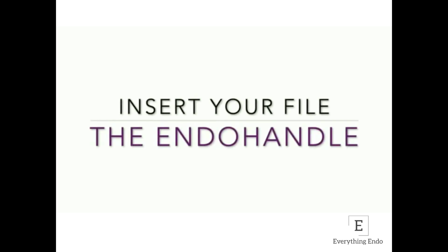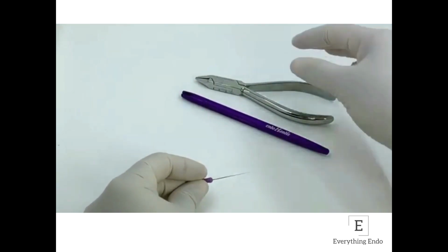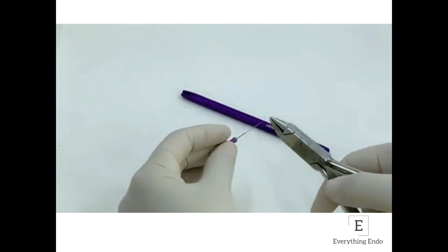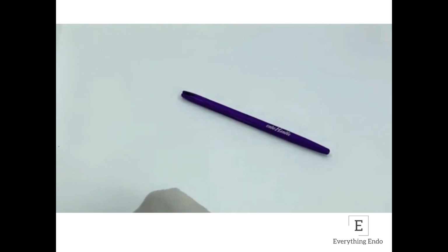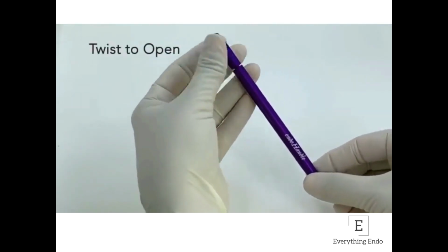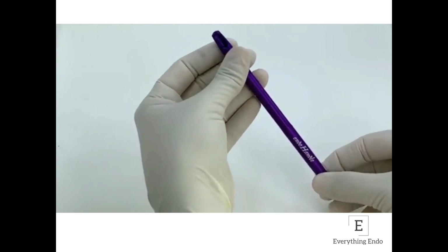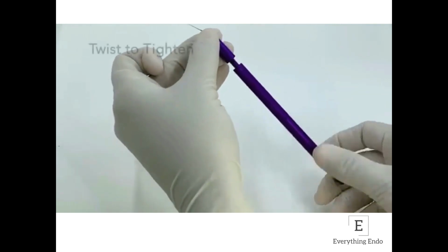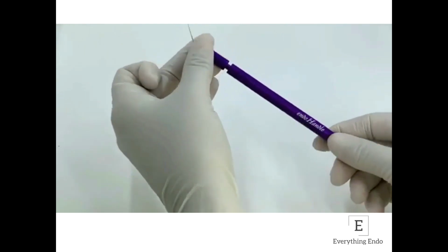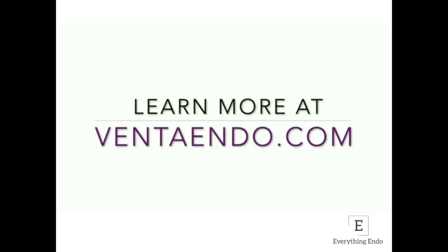This is just a product video from the company on how these endo handles work, just to give you an idea. So that's just the conventional K file, which is pre-bent with a plier. It's a very self-explanatory video. So you just open up, insert the file inside, and lock it back on. So as long as you don't lose the handle, you can keep reusing these handles infinitely.